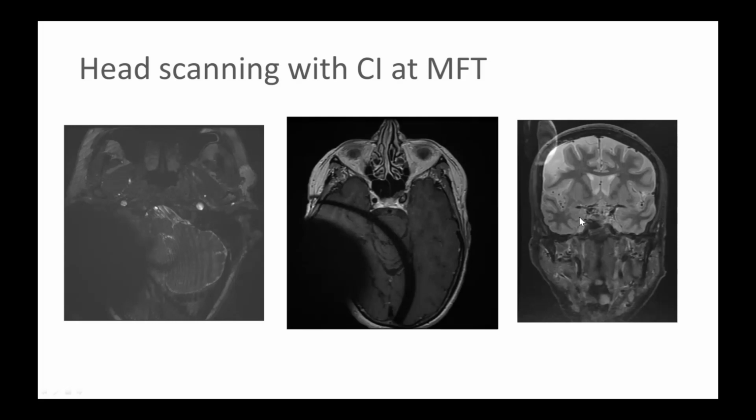And the final slide shows the results of a STIR sequence coronally with the cochlear implant magnet in situ on an adjacent slice. The actual geometric fidelity within the plane of the image is quite good itself, but you do get an extra copy of some brain anatomy in the top left of the image for free, which is quite unusual in appearance and may give uncertainty about diagnosing any pathology up in this region of the image.